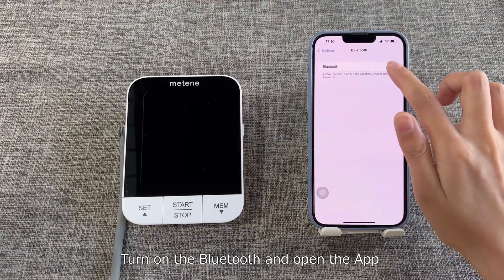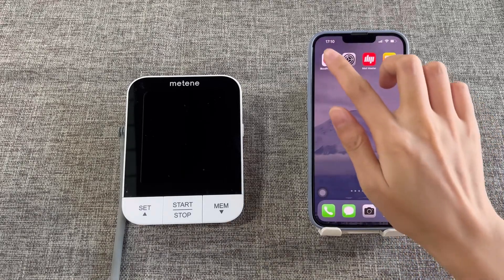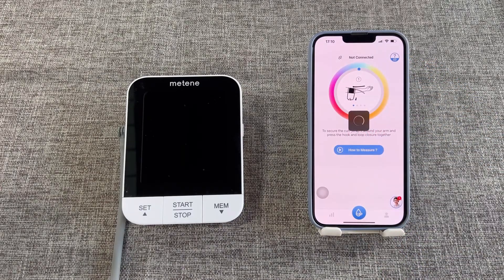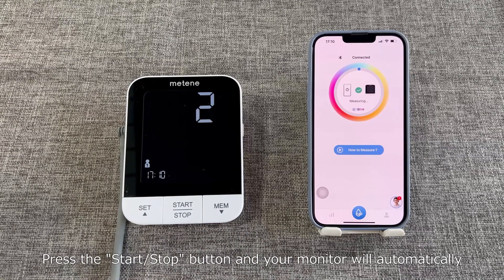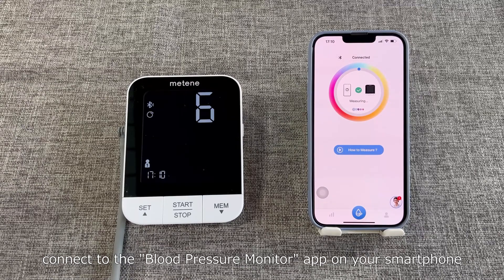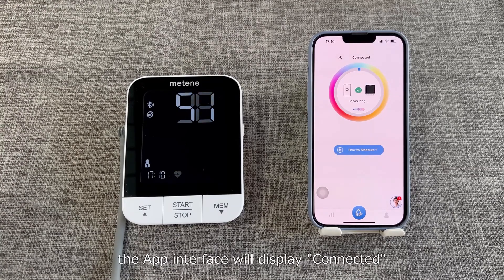Turn on the Bluetooth and open the app. Stay on the measurement page of the app. Press the start/stop button and your monitor will automatically connect to the blood pressure monitor app on your smartphone. After the connection is successful, the app interface will display 'connected'.